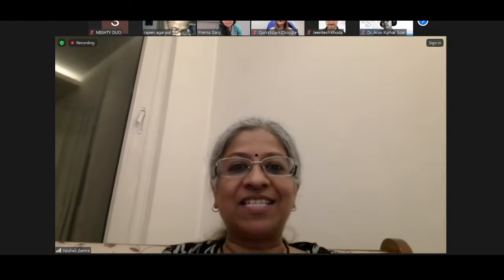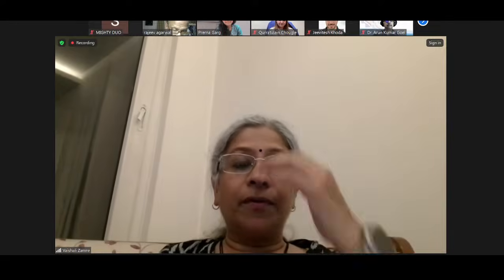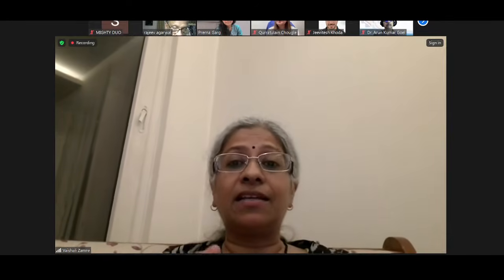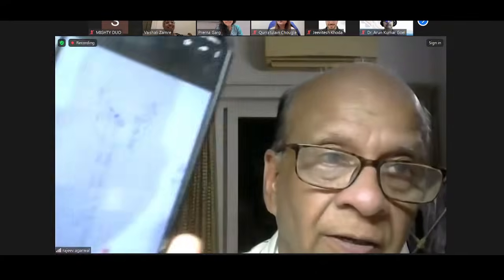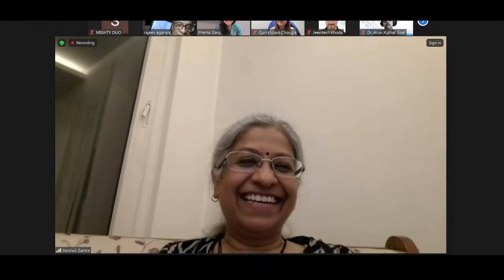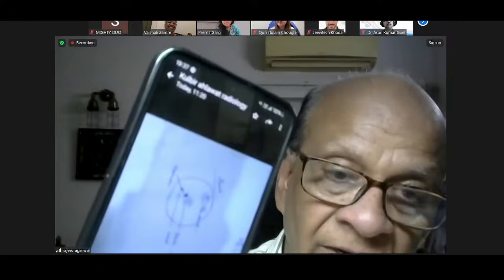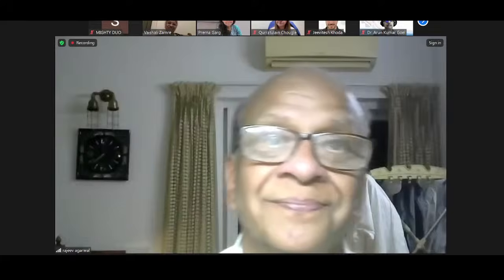So, as Dr. Rajiv has rightly pointed out, it is very critical for the clinician, the operating surgeon, and the radiologist to be on the same page. Like today only, I have done a bilateral wire localization, and Dr. Kulveer Elawat has sent me a diagram like this, because the wire actually overshot the lesion a little. So he pointed out to me that from the point of entry, this is the distance of the lesion, and this is the distance of the tip of the wire.